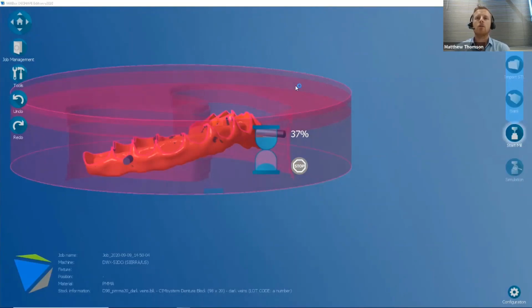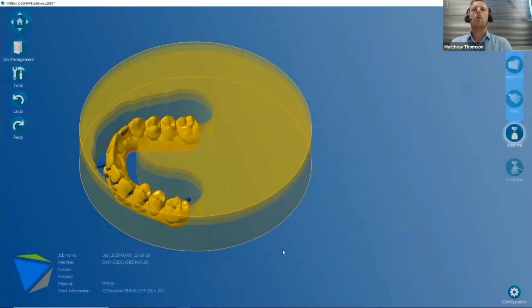Having the pink base is really nice to have, ensuring we've got the undercuts and ensuring we've got that PTS file to give us our sockets. So as long as we've got those three things, we're going to have a really great milling result, irrespective of what machine we use. Now let's move on and we'll go look at how we can mill out the crown and bridge example that Jeroen designed for us before.